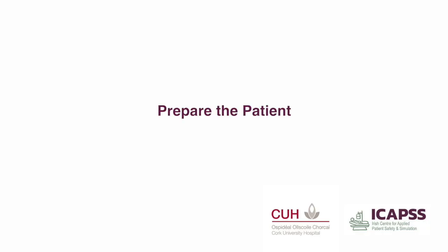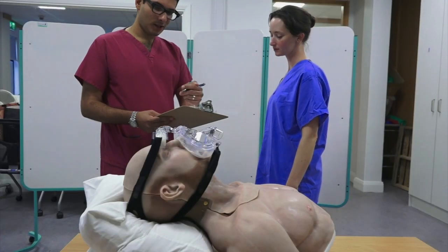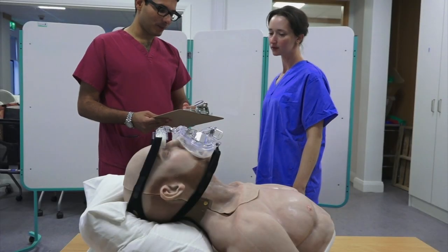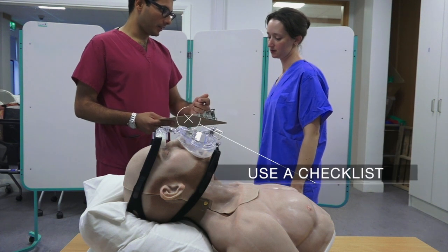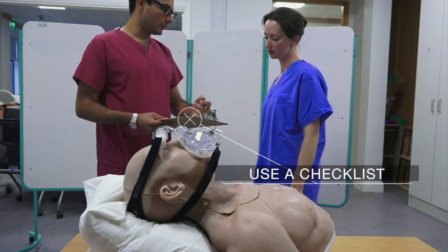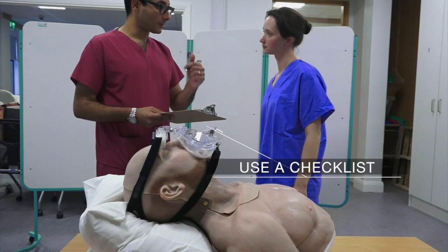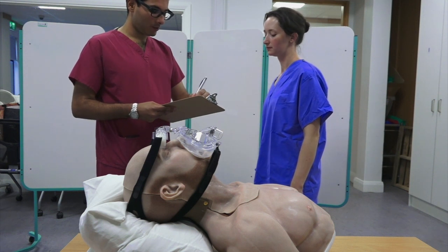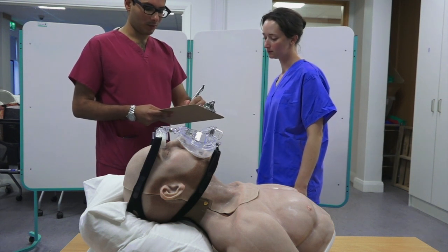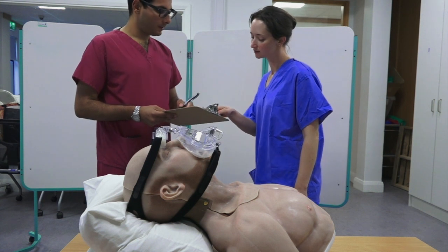Now undertake steps to prepare the patient for intubation. Use a checklist for preparation. Discuss the indication for intubation, alternative approaches, risks, and benefits. Discuss the airway plan, assign team roles, and address team member questions and concerns.